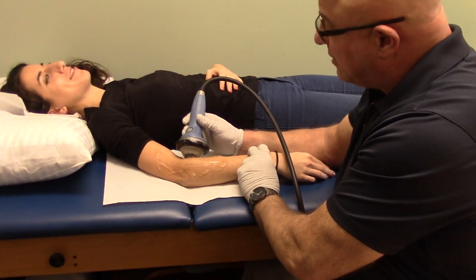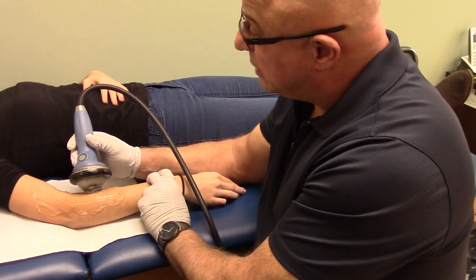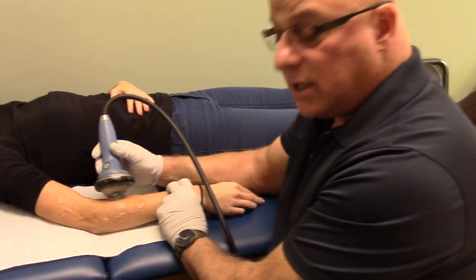Sorry, it got more intense right over here. Do you want me to turn it down? Yes. Okay, so let's go down.